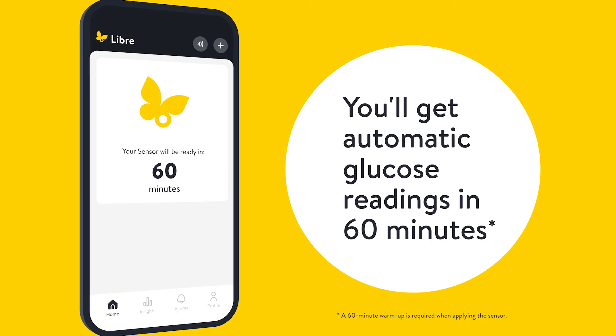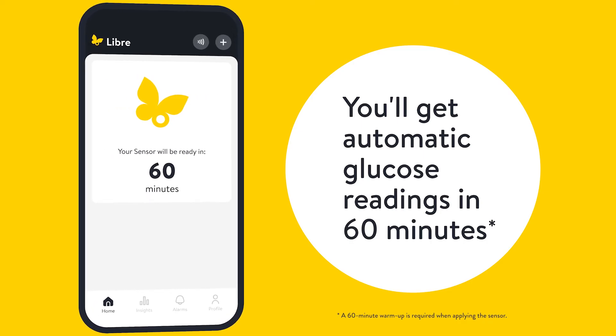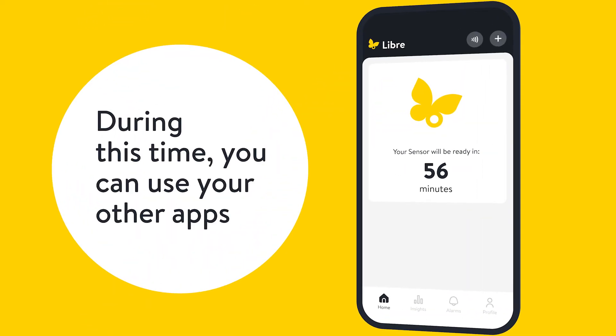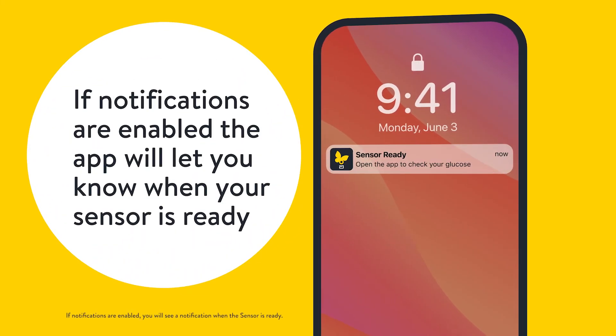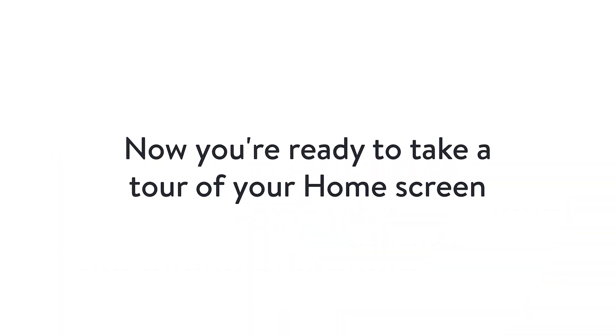You'll get automatic glucose readings in 60 minutes. During this time, you can use your other apps. If notifications are enabled, the app will let you know when your sensor is ready. Now you're ready to take a tour of your home screen.